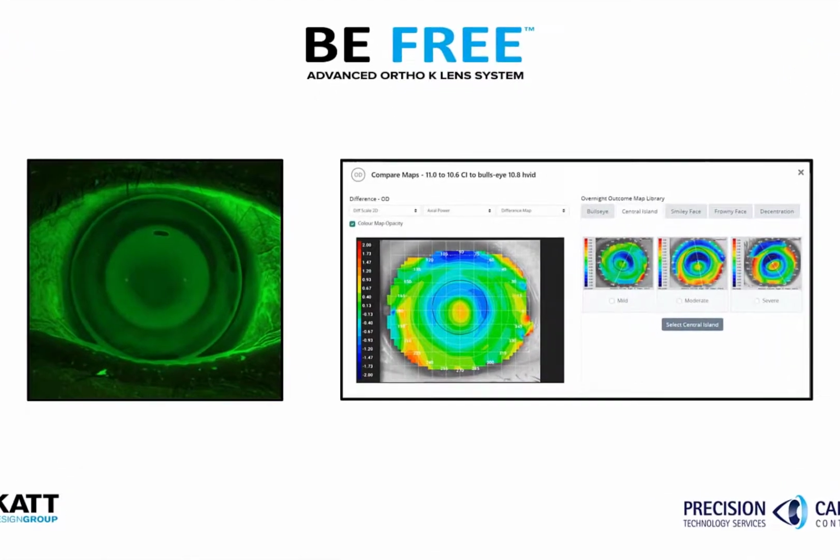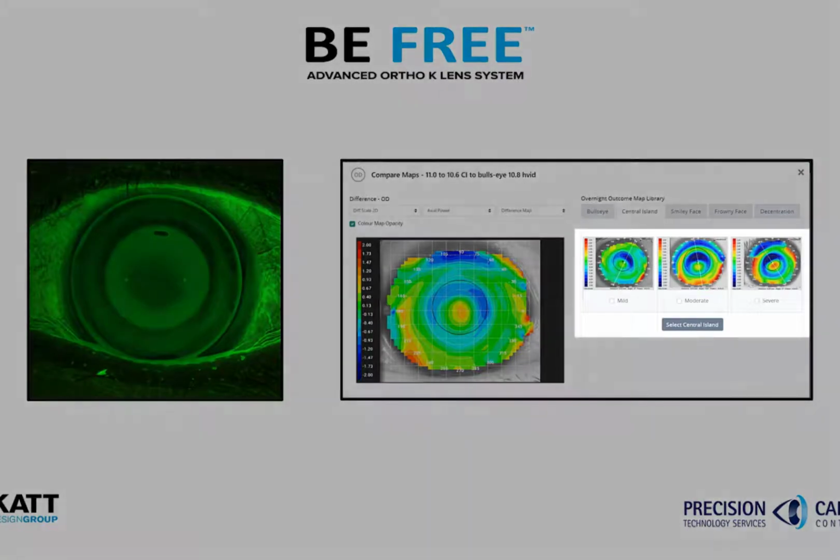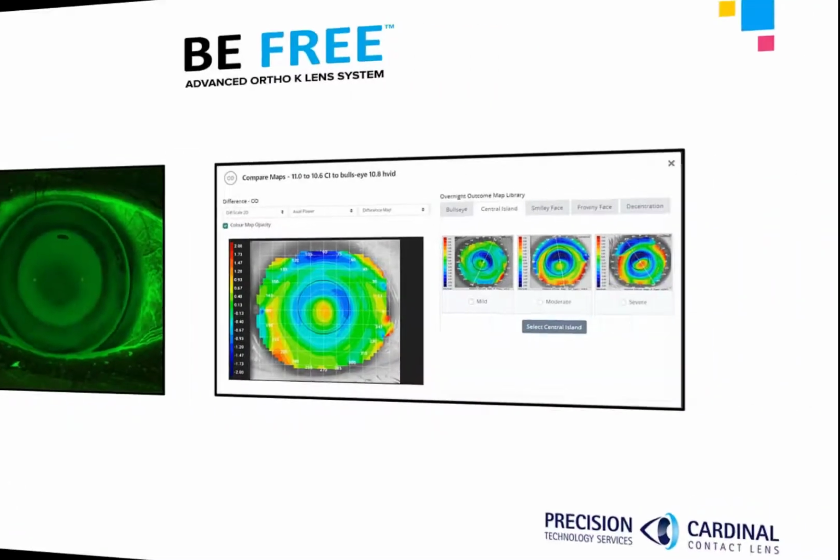Excessive apical clearance and persistent dimple veiling are resolved with the central island response, which reduces the vault and tear thickness under the lens. Based on the appearance, choose mild, moderate, or severe.